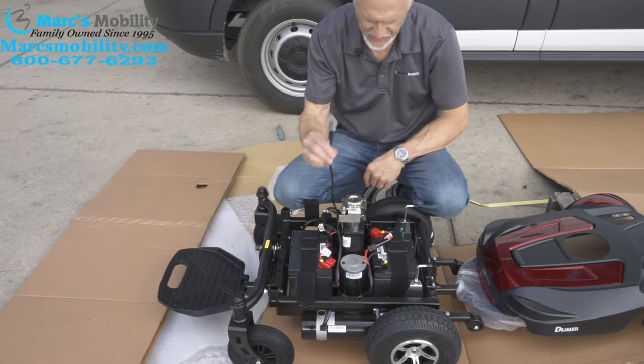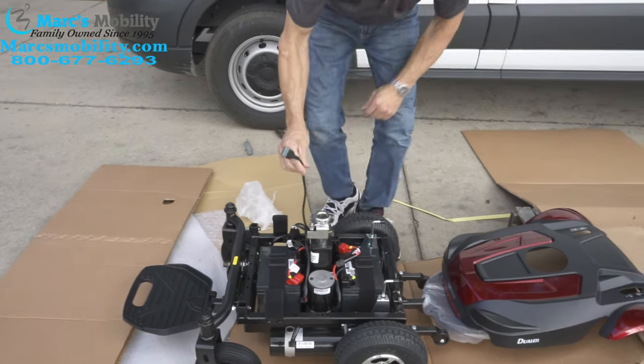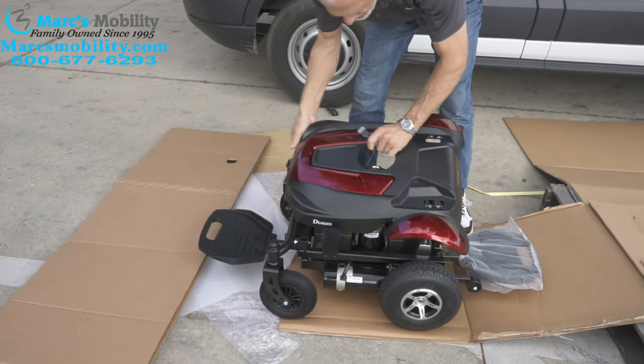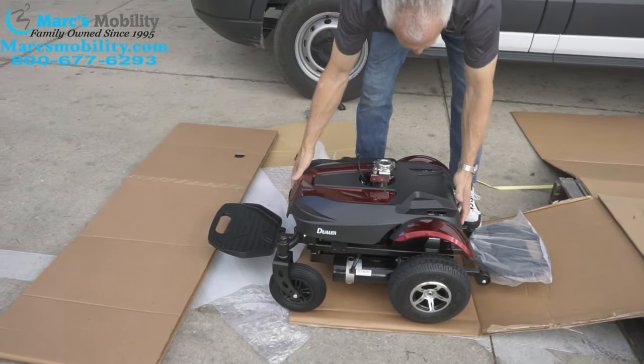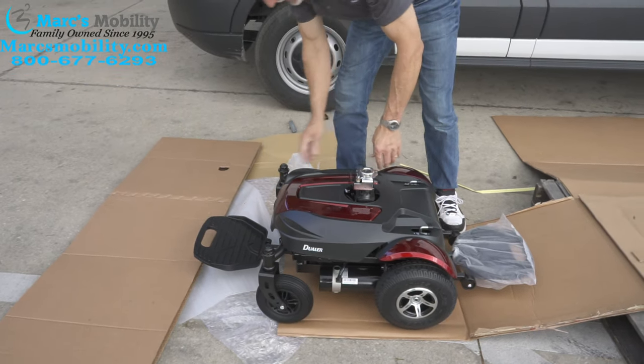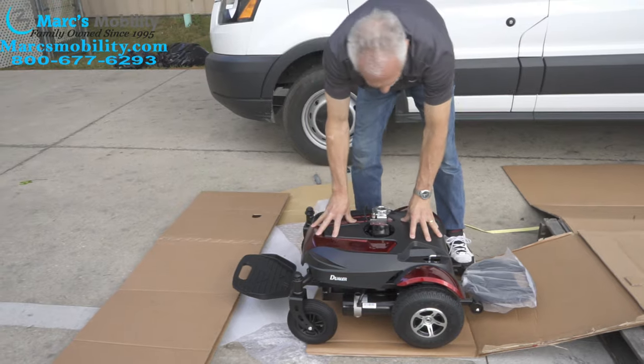The only thing you have left now is your joystick cable, and that cable right here has to come through here. If you don't do that before you put the cover on, you'll have to take the cover back off, and that'll be a problem.